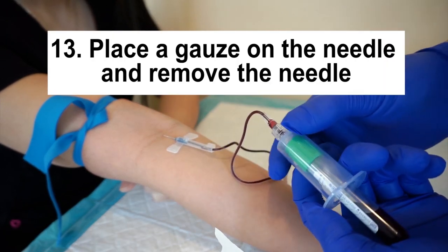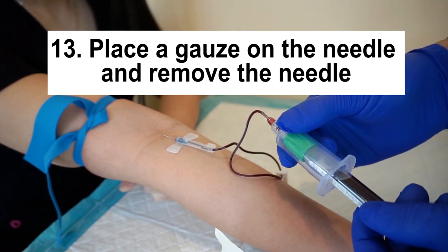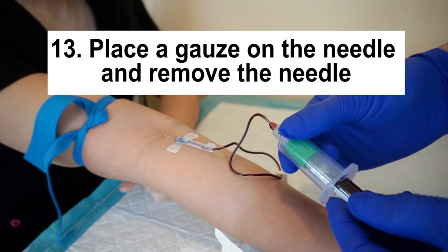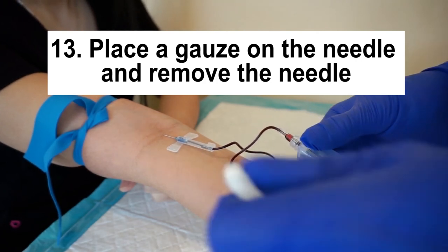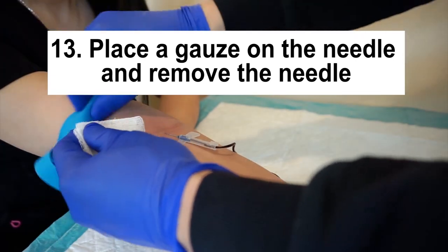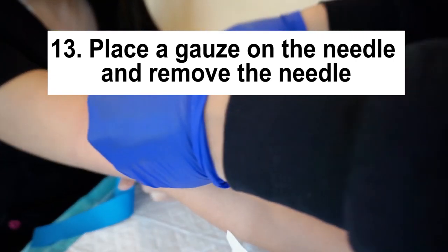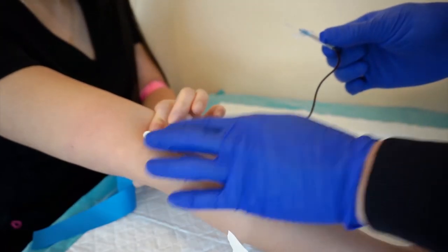Thirteen, when you draw the last tube, place a gauze on the needle and remove the needle. Do not press down on the gauze because you will be pressing on the needle that is still in the patient's arm. You can also ask the patient to hold the gauze. I usually ask the patient to hold the gauze because that will reduce my risk of finger prick as I remove the needle from the patient's arm.